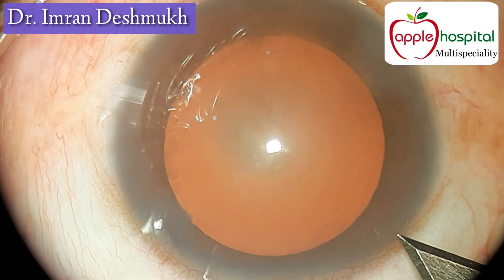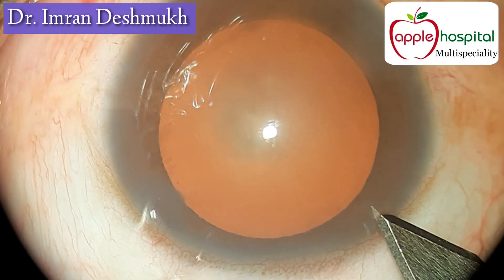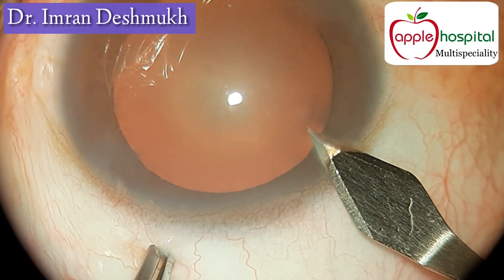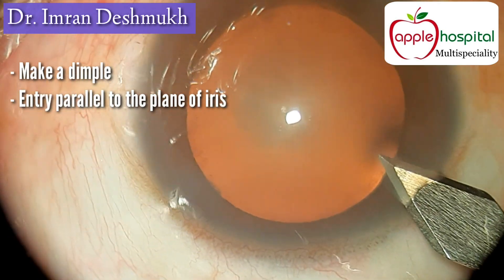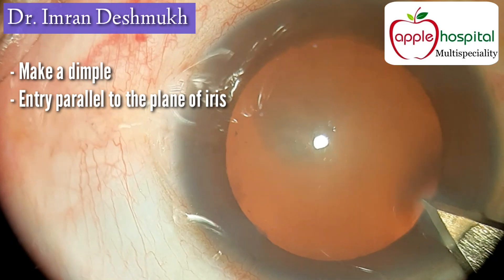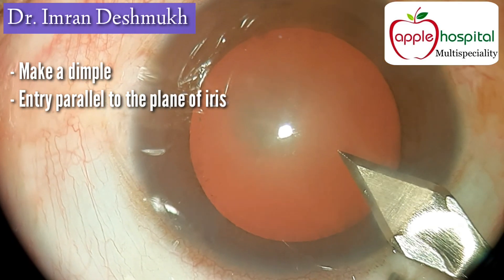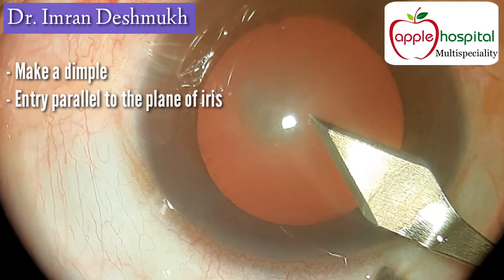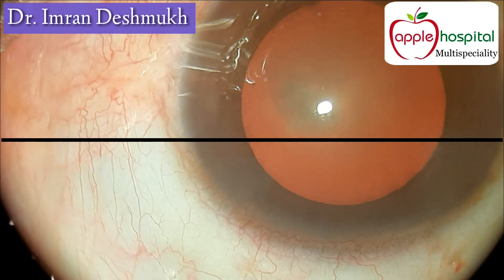In the second case, make the first plane, enter the cornea, then slowly enter the plane of the cornea making the second plane. Be slow and steady, make a dimple — this is the third plane. Enter the anterior chamber; this entry should be parallel to the plane of the iris. Be very careful and very slow and steady, as this is a very important step of phaco surgery.